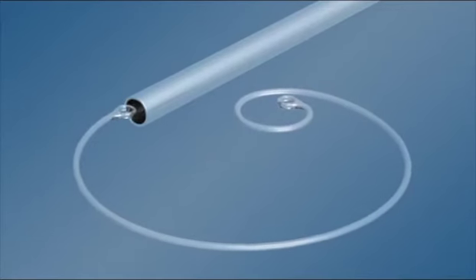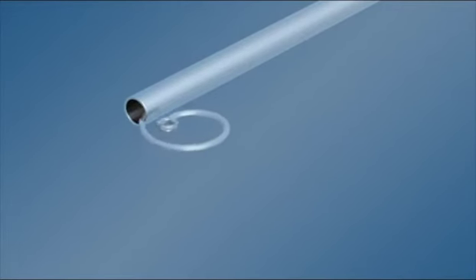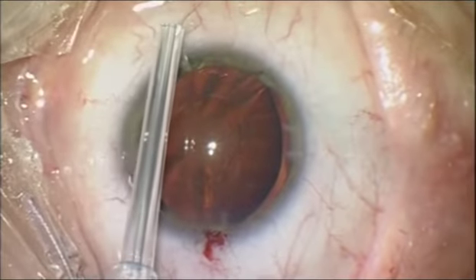Dear colleagues, let me introduce you Malyugin CTR, which is the device designed for scleral fixation. Implantation of CTR is performed with the help of the injector.